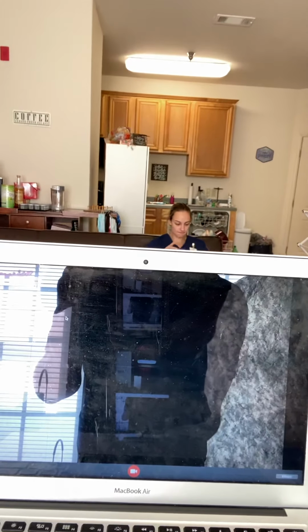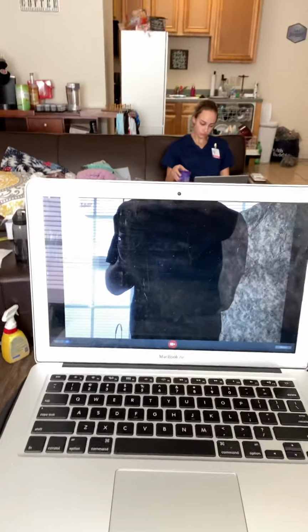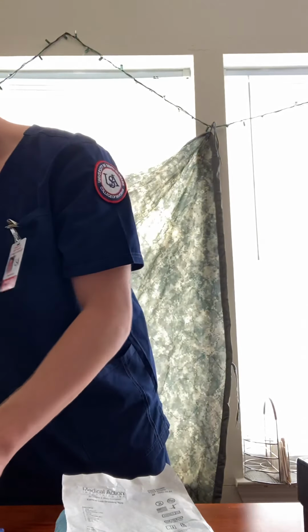As you can see, I have tried to use the Panopto setting on the computer to record. However, it was not working, so I'm having to use it to prop up my phone. Okay. So now that I have the camera positioned, I'm going to get my patient care order form and verify my hospital policy for the CVAD requires a dressing change. So after I've done that, I'm going to make sure I have all my equipment available, and I do.